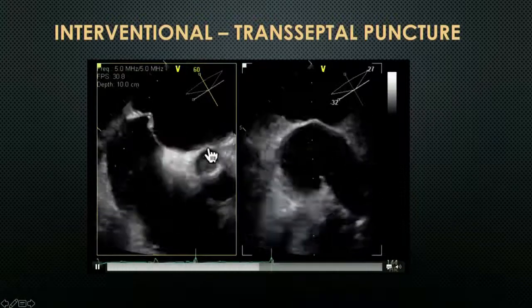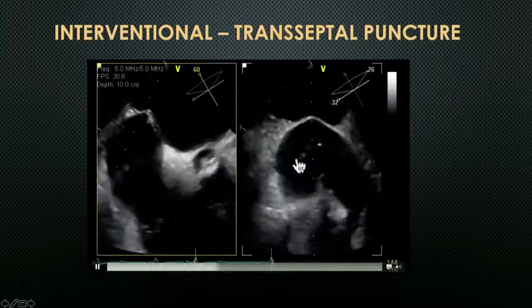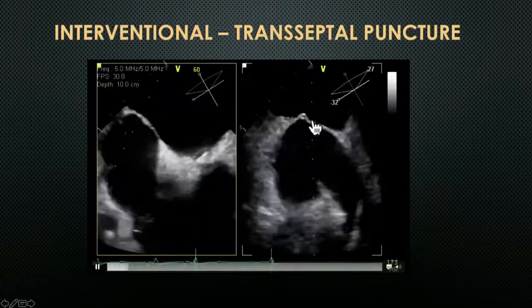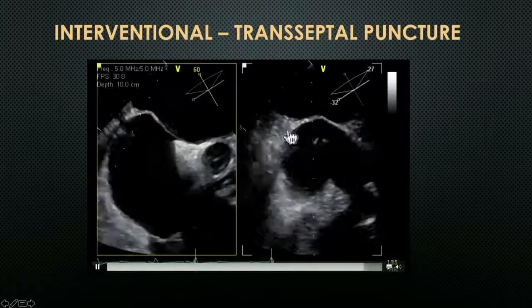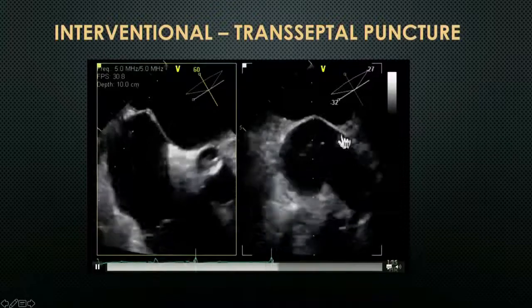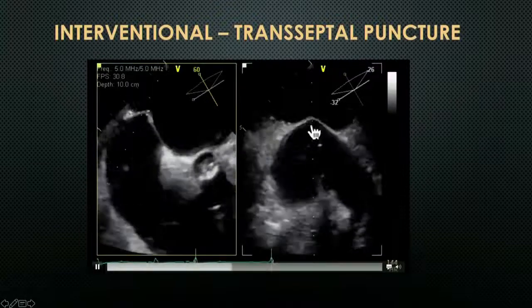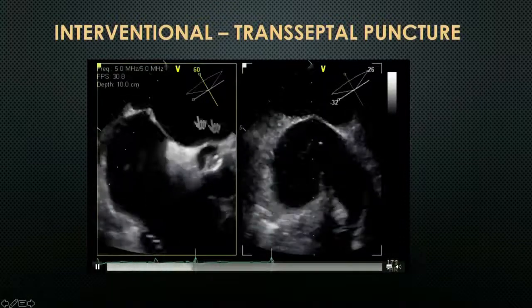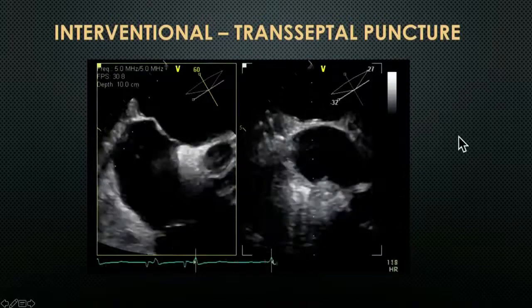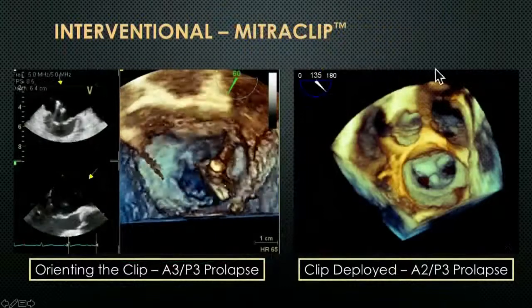posterior margin of the thin part of the septum, and using a subsequent image over here, simultaneously, we can tell them that it's sort of more inferior. This would be more superior, that's more inferior. So it's inferior and posterior, and that would be appropriate for certain procedures.